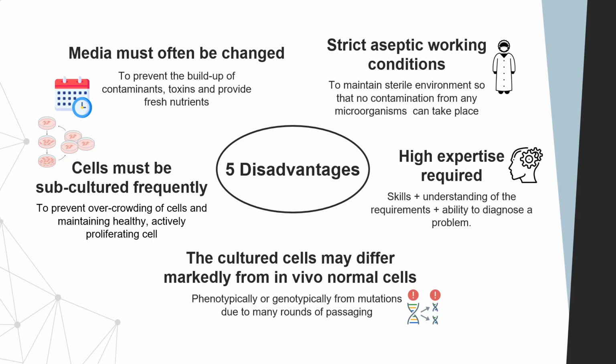So to achieve and maintain these strict aseptic conditions really requires your meticulous attention to detail. Okay, and you have to really adhere to sterile techniques throughout all aspects of cell culture. Any breach in any of these aseptic techniques would then lead to contamination and then of course, creating delays or setbacks in researchers' research.